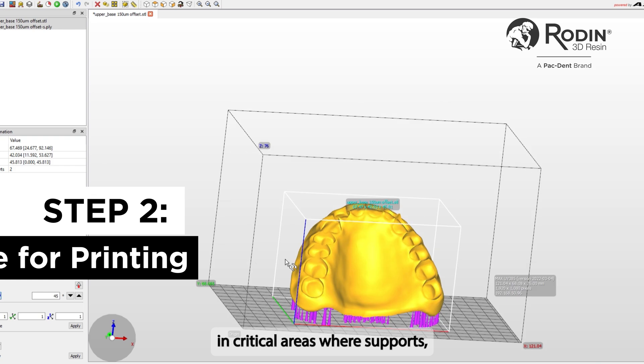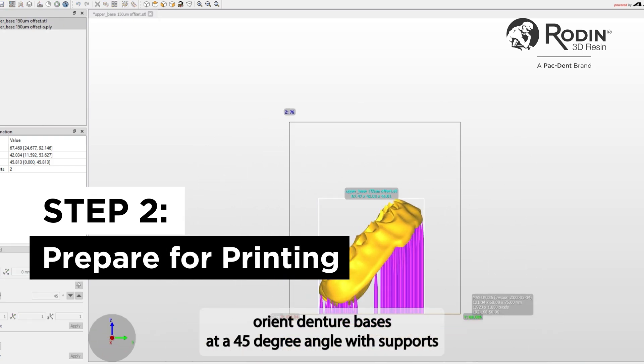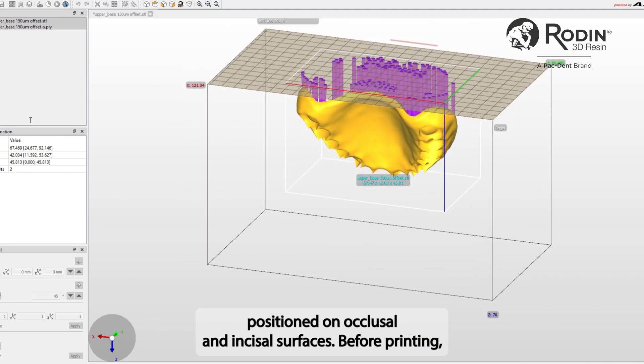Particularly in critical areas where supports first contact the denture base. For best results, orient denture bases at a 45-degree angle with supports positioned on occlusal and incisal surfaces.